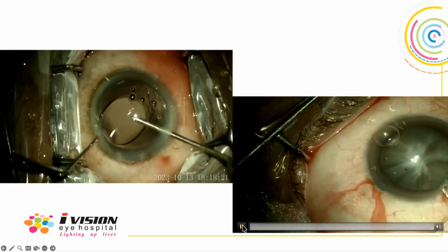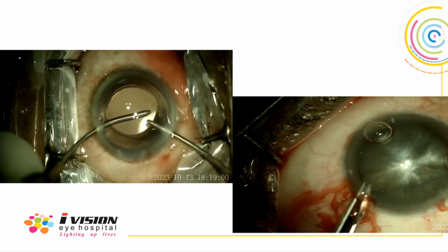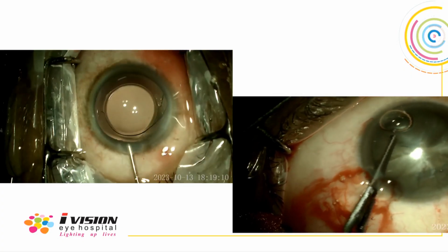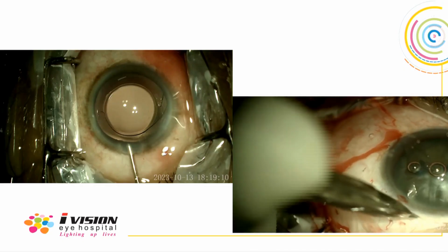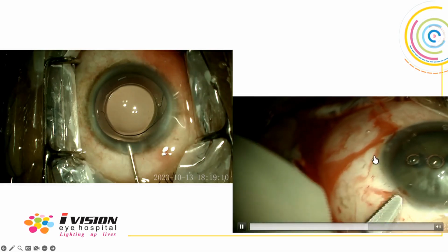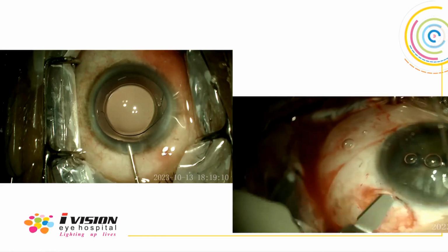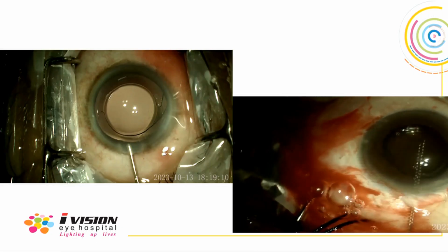Sometimes it can extend posteriorly also. However skilled you are, sometimes it happens, and I didn't do anything. That was an Argentinian flag sign. The rhexis got torn. And this is how you should extend the rhexis, cut on either side, but I could not make it. So that was a clear corneal temporal tunnel here, and I am doing a superior SICS now. And as my rhexis was all damaged, I implanted a three-piece foldable IOL in the sulcus.